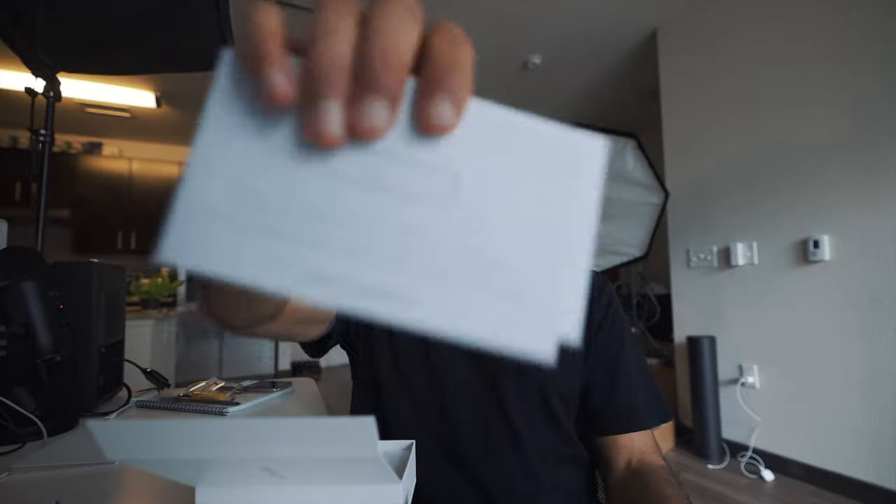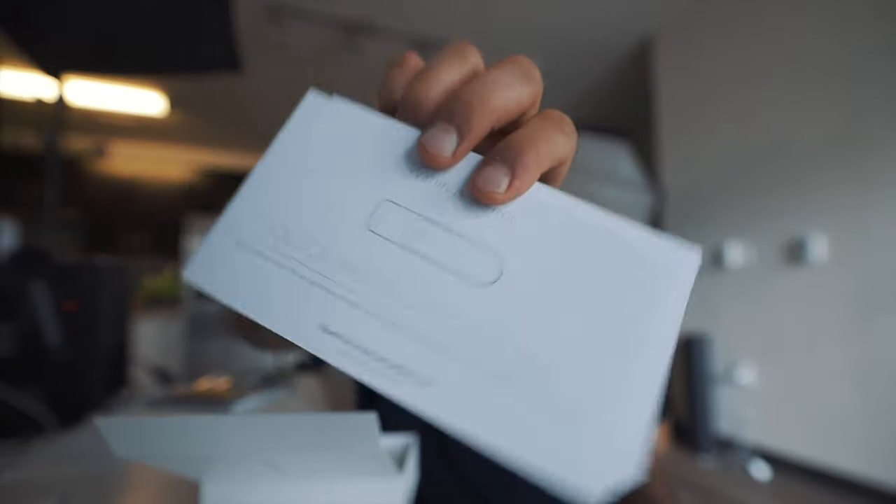Then inside the box, we also have these manuals. Pretty useless, right? Nah, I'm just kidding. Quick start guide. I would assume as a relatively technological person, I don't need to read these. I can just use the app and we'll figure it out. There's probably like an on button, Bluetooth connection, and we'll be good to go.